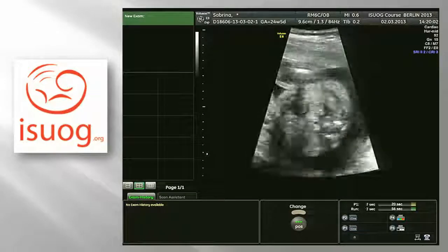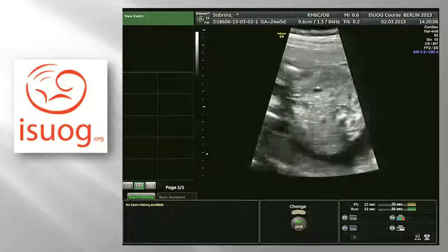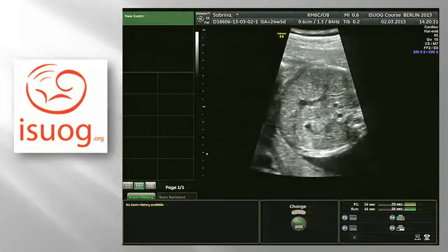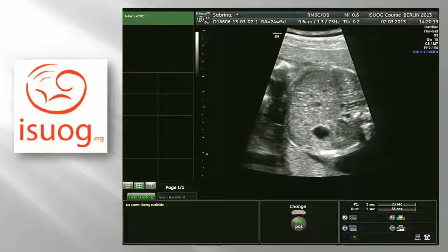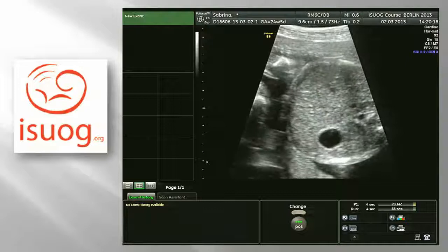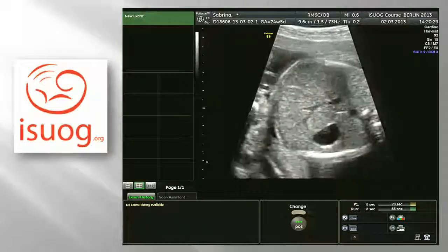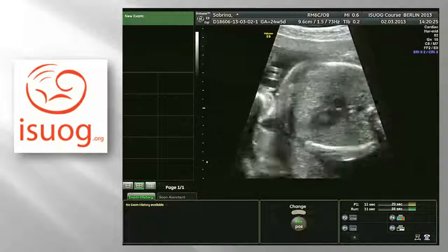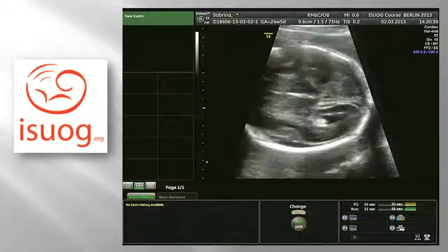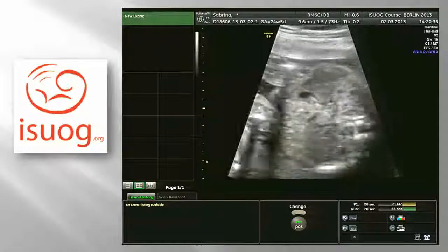She's behind. Okay, so she detected this condition at nuchal screening at 13 weeks. It's a right-sided aortic arch, and we did the invasive testing. It's normal. And I saw the lady last week for the second trimester scan, and she was so kind to come. So, Kai, can we start? Yeah, you can. Okay. So, the fetus is at 24 weeks, and the fetus is in a vertex presentation.